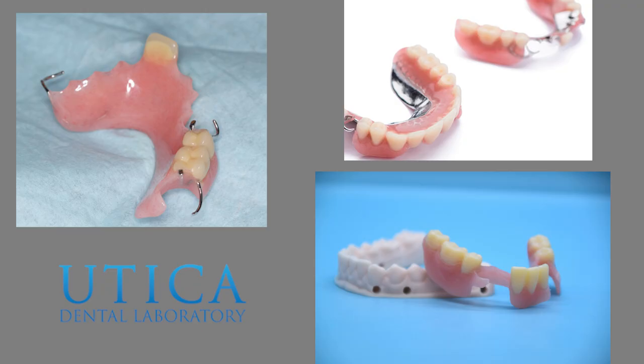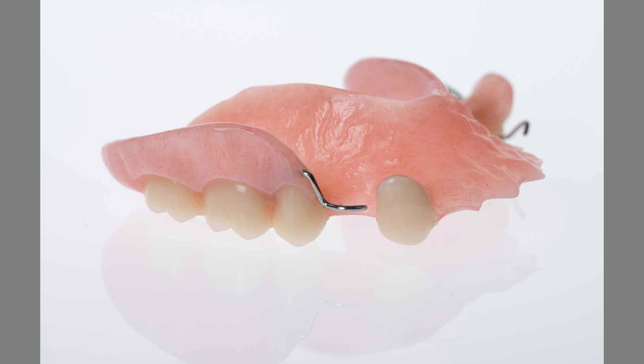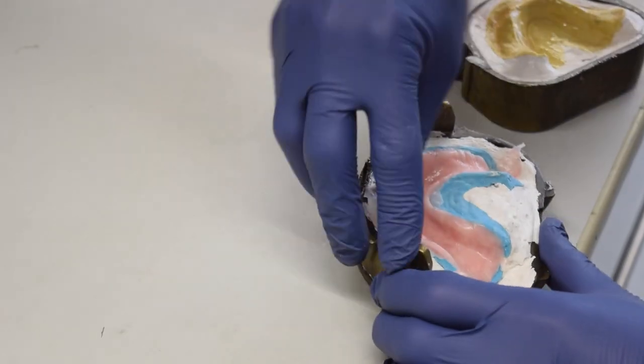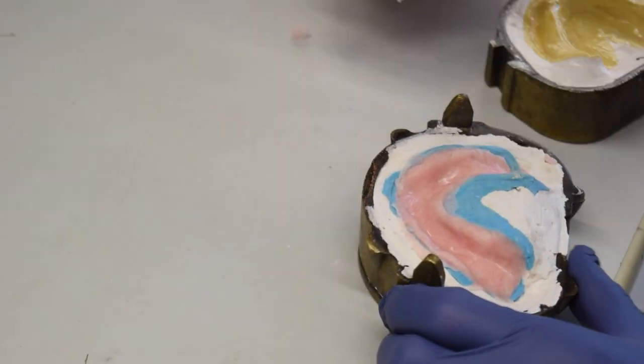There are three types of partial dentures that we make at Utica Dental Lab: acrylic partials, metal partials, and flexible partials. Acrylic partials are made with an acrylic base and acrylic teeth. Metal wires are typically added to help hold the partial in place. Like traditional full dentures, acrylic partials are made with Lusitone 199 via the press pack method.